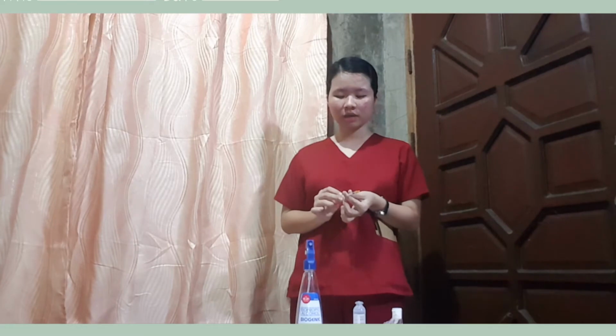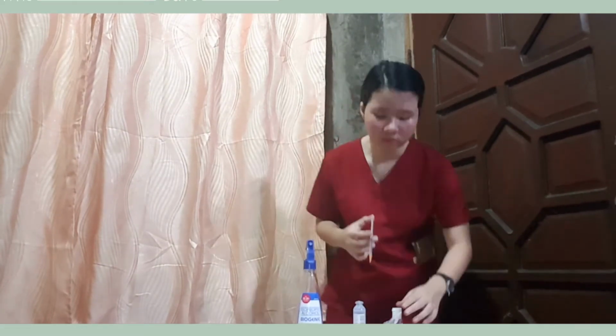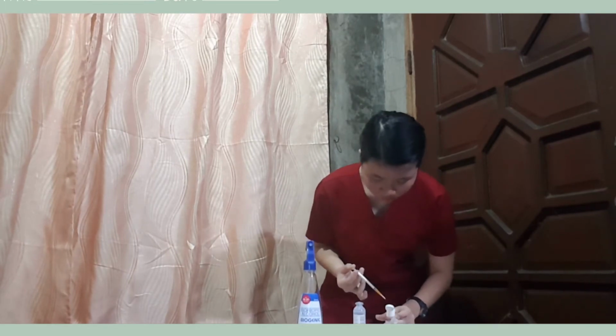And for the other one, injection of an equal amount of air is required to prevent the formation of a partial vacuum when you're going to get the amount later that you're going to be needing.